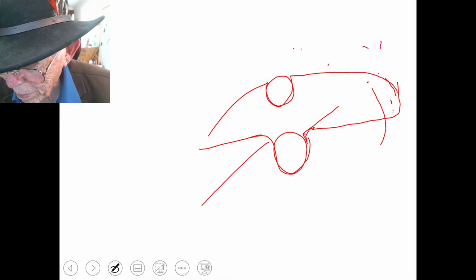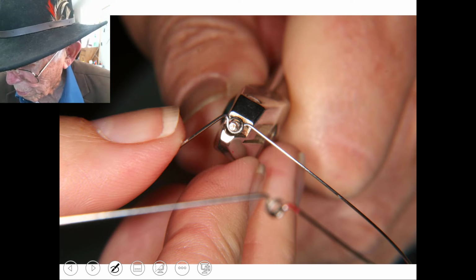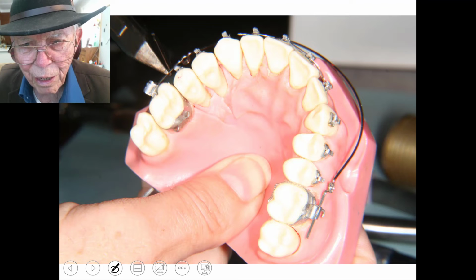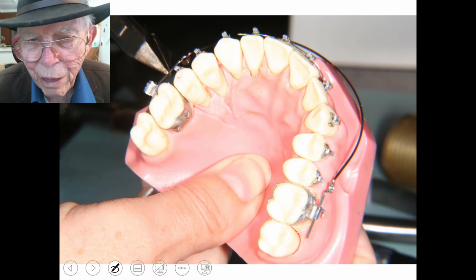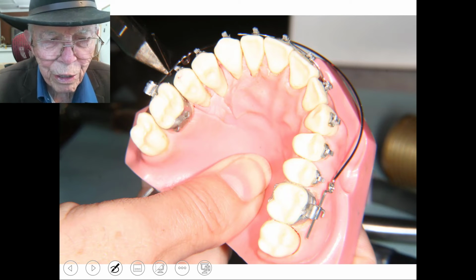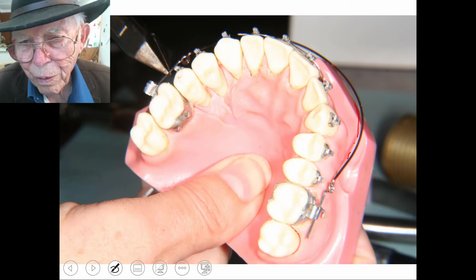Let me get back on the deal. So here we have finished that, and we activate that, and I'm going to hook this into a typodont, which doesn't have a deep bite. If it did, these teeth would be hanging down a lot higher. These are upper teeth right here. And we've got this loop that comes out here, and it comes up like that.